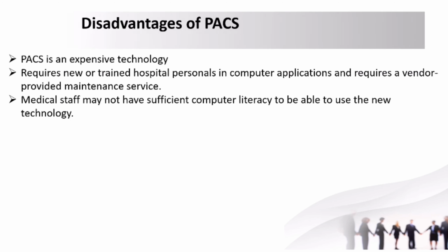Moving forward, we have the disadvantages of PACS. PACS is an expensive technology. It requires trained hospital personnel. Like not everyone knows how to use a computer, so first we have to train them. So this is one of the disadvantages, or we can say drawbacks. Then last, medical staff may not have sufficient computer literacy, as I have told, to be able to use the new technology. So we have fewer disadvantages of PACS, but there are more advantages of using PACS.